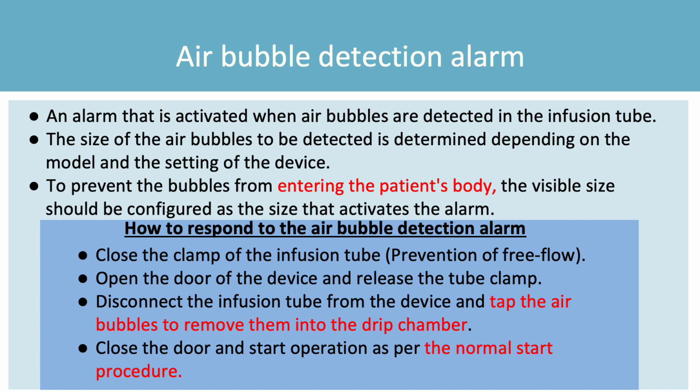The causes of air bubbles include an empty IV bag and insufficient priming. Users should resolve those alarm conditions by following the procedures described in the slide.